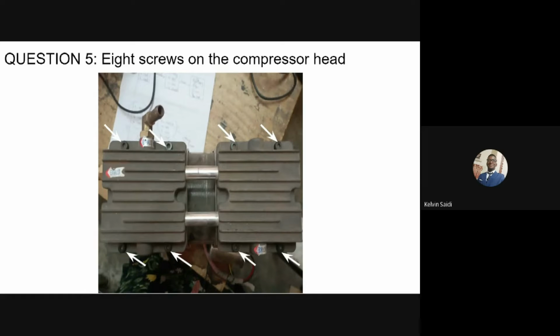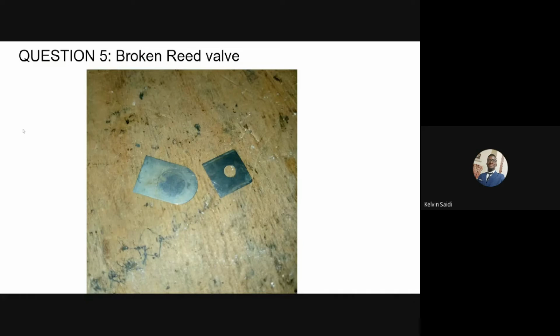The compressor flapper valves should be flush with the valve plate. This means that there shouldn't be any spacing between them. If the valve is broken or it is not flush with the valve plate, or foreign matter is detected inside the head, you need to clean or replace the compressor flapper valves.